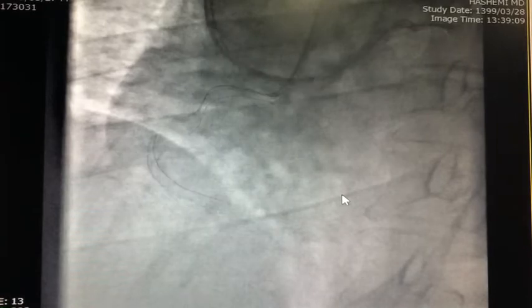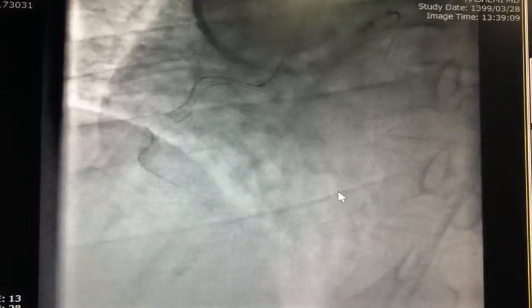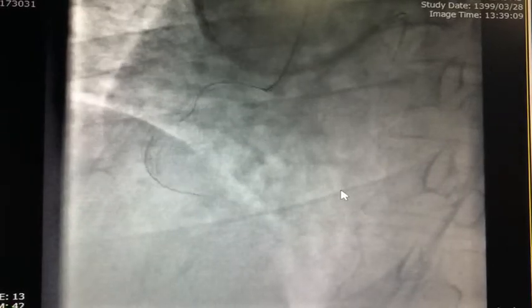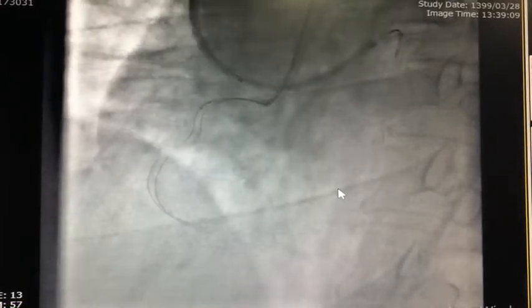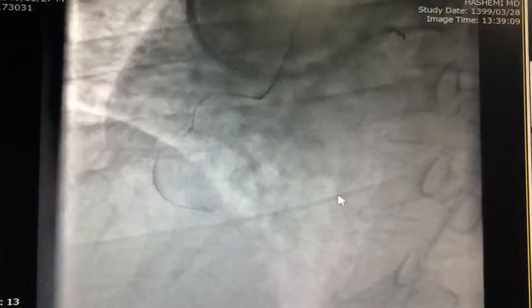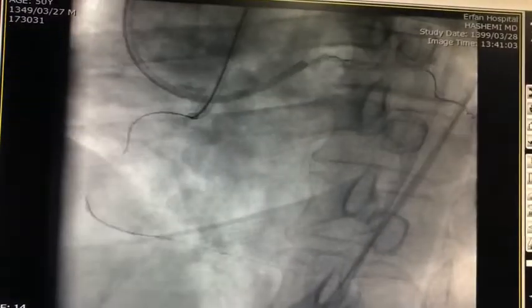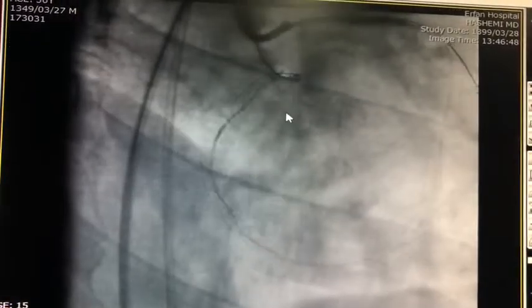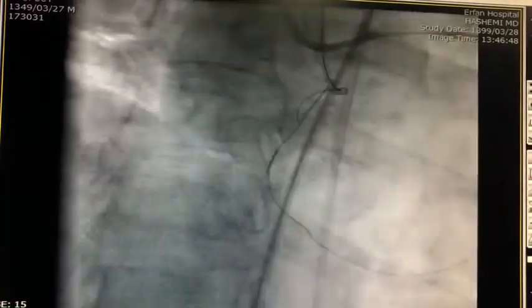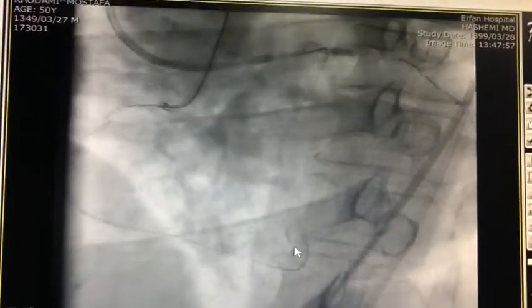So if we wanted to do the reverse CART technique, we had to use a large balloon, and the risk of complications was higher, and IVUS wasn't available at the time to check the planes of the wires. Then we tried different retrograde wires and changed to Pilot 150. These are the tries for retrograde wiring. As you can see, there's too much gap between the two wires in this projection. We tried to manipulate the retrograde wire with Gaia 3.